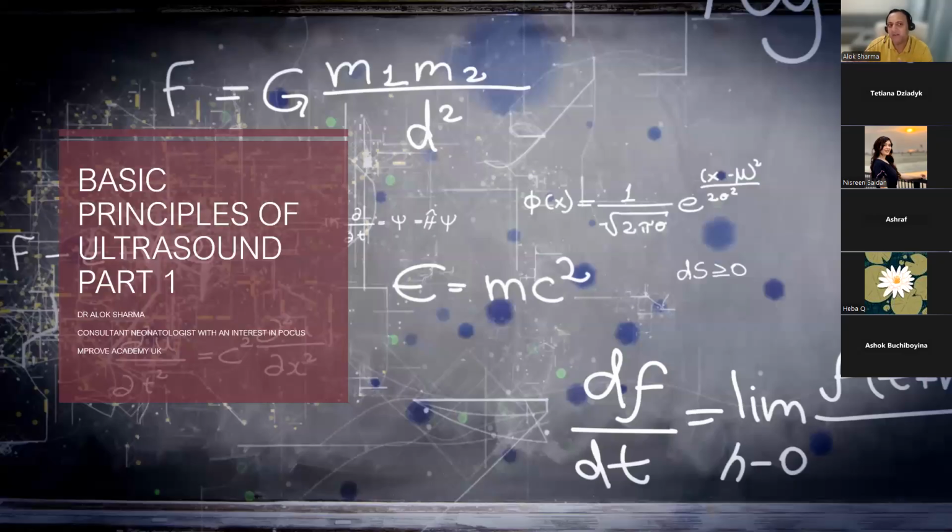An artifact is really not tissue. It's really an amalgamation of how sound waves interact with the lung tissue to generate certain what I would call artifacts, which we then interpret by pattern recognition.